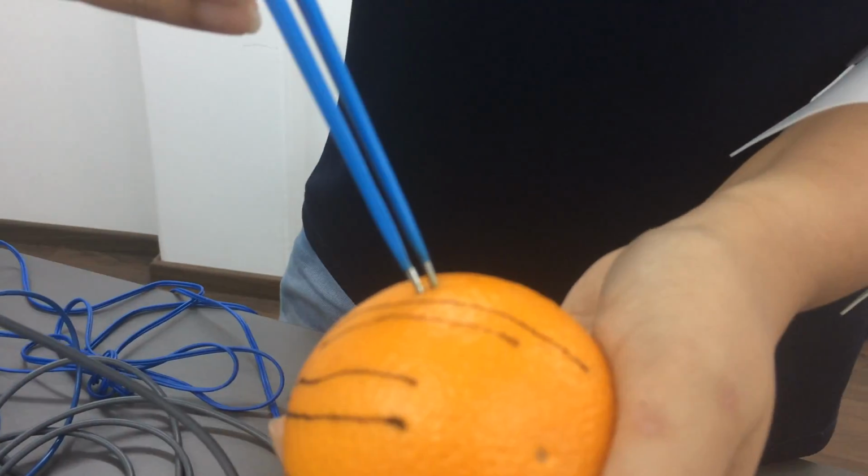Then we will show you the bipolar forceps.